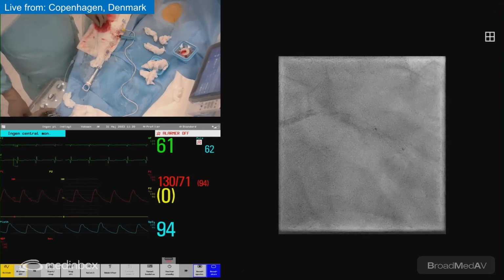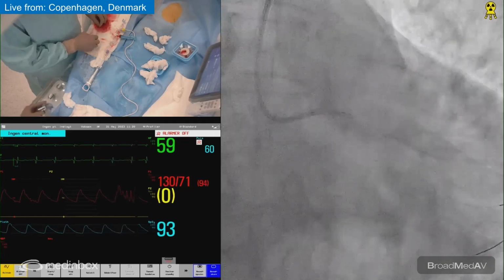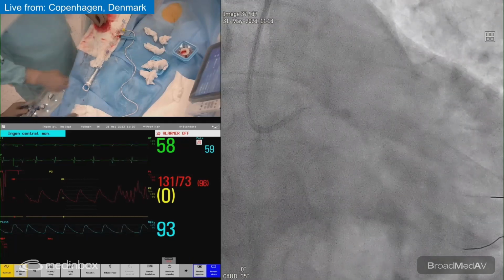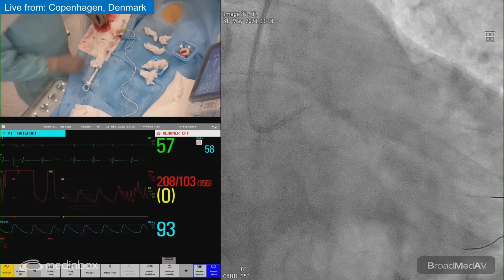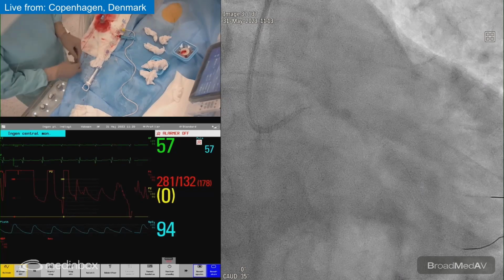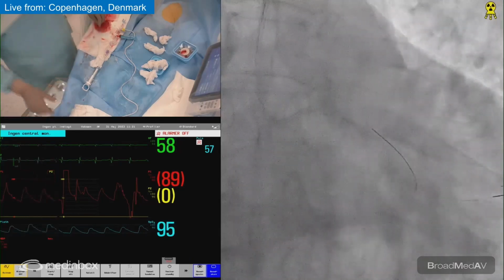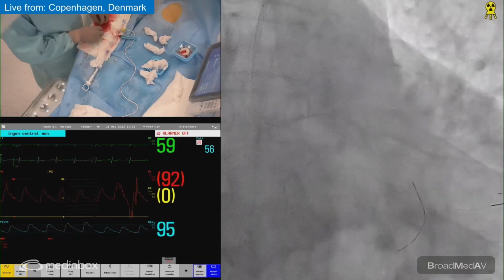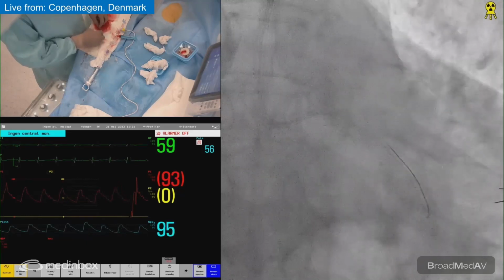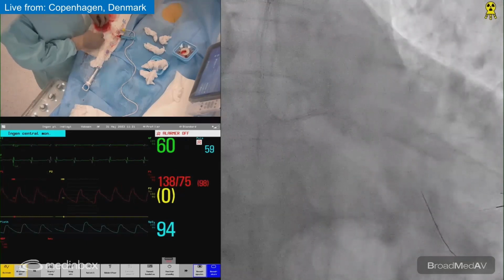When you have brought down the next stent, you should probably retract the jailed wire, because we don't want to jail it behind, especially when we have an overlap between the two stents. So we bring down the stent. We use the jailed stent as some sort of anchor if there's any resistance.